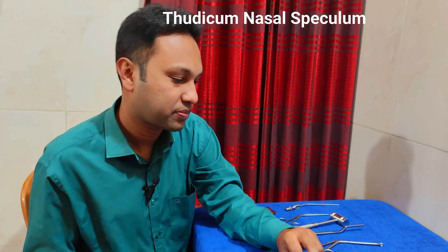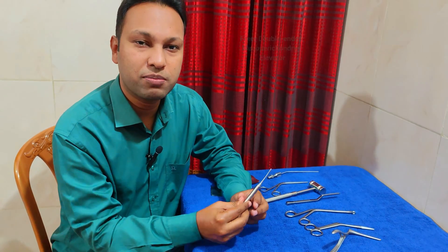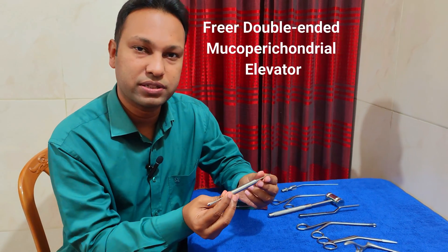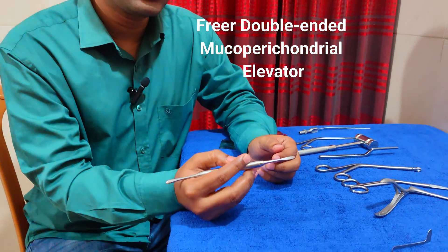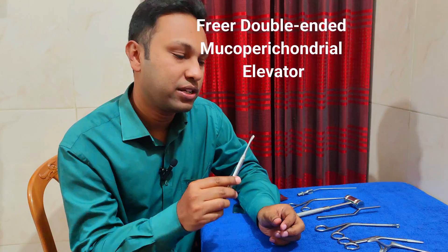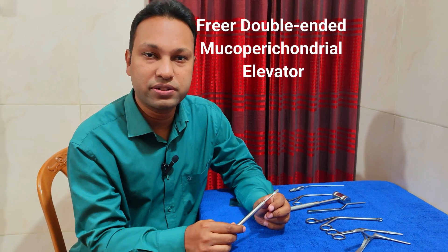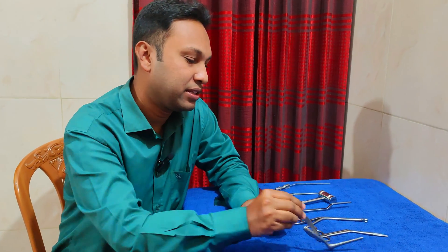This one is the Freer double-ended mucoperichondrial elevator. After giving the incision, we use it for raising the mucoperichondrial or mucoperiosteal flap. It is also used for fracture of the inferior turbinate.